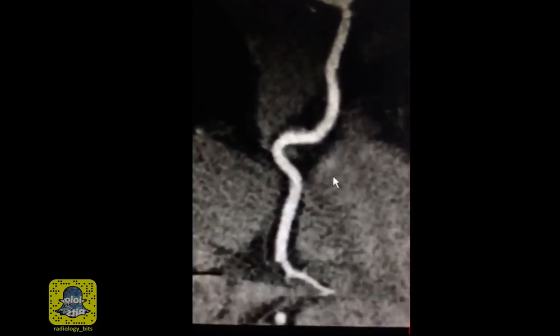When you do it for the coronary arteries, you could look at those vessels in a similar fashion to what's done on catheter coronary angiogram. False positive results is the enemy on cardiac CT, however, it has a very high negative predictive value, which means you want to do it in low to intermediate risk patients where you want to confirm normality and not abnormality.